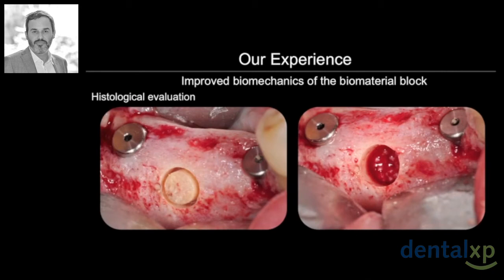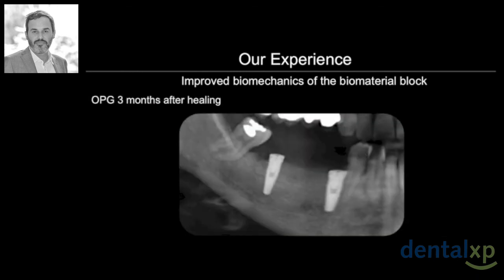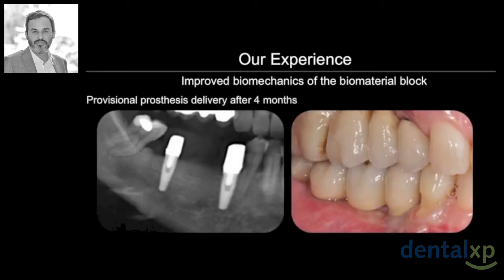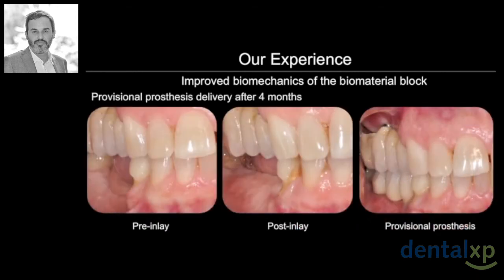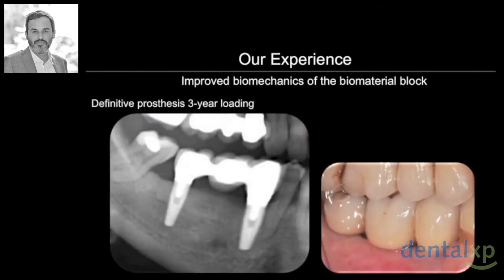Bone core sample, look at the quality of the bone. X-ray after surgery. The situation after 3 months. Provisional rehabilitation after 3-4 months. Before and after the surgery and the rehabilitation. 1 year later and 3 years later.